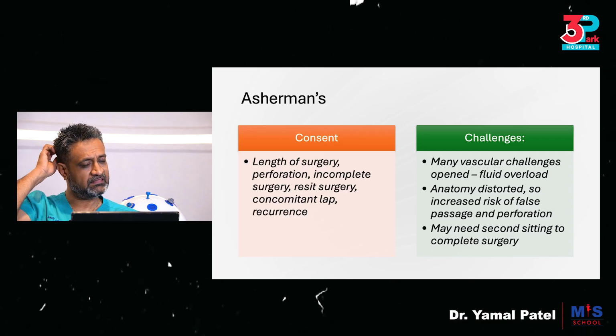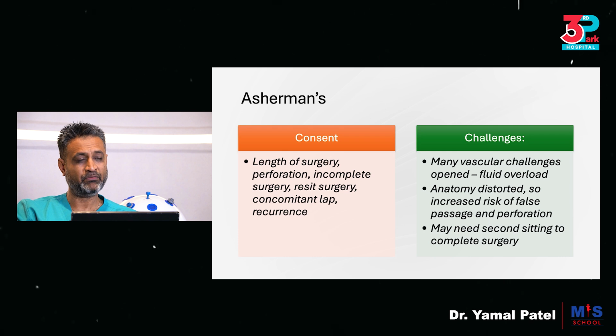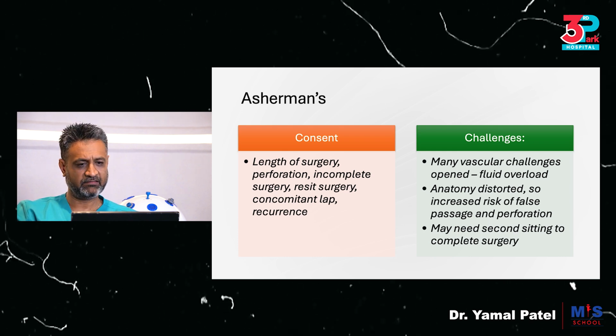And it's also possible to avoid this by doing it under ultrasound guidance. So you're doing your procedure, whereas there is an ultrasound probe from the anterior abdominal side that could guide you on where you are, so that you're not leaving the endometrial cavity and going into the myometrium and coming towards the serosa for a perforation. And it's also important to discuss that there is a risk of recurrence in these conditions, but we will take certain necessary measures to avoid recurrence.